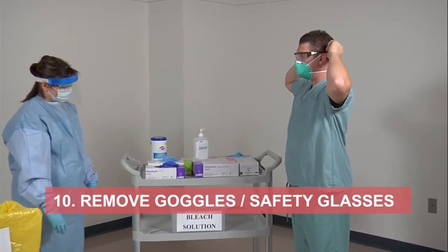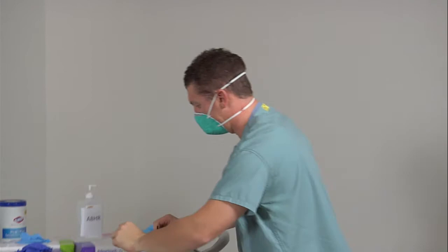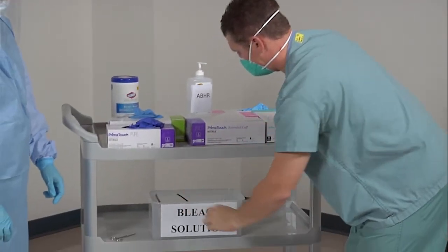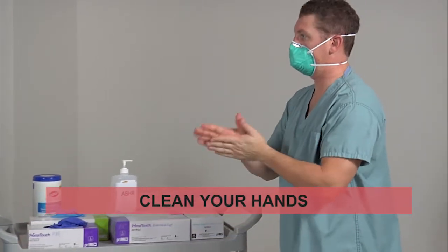Remove your safety glasses by grasping the arm of the glasses from behind your ear. Remove and place in a bucket of bleach solution. Clean your hands with an alcohol-based hand rub.